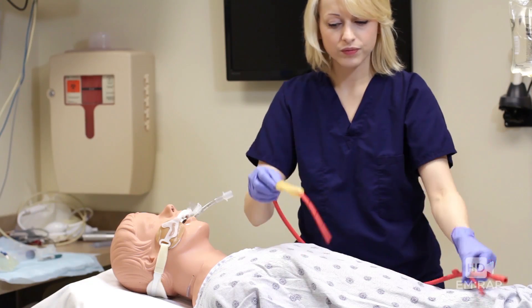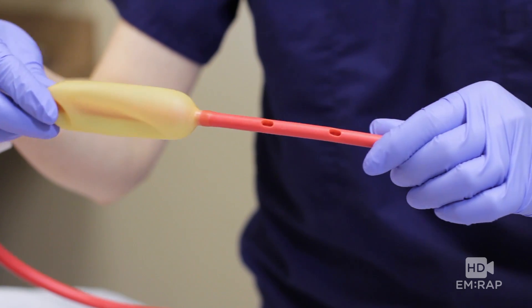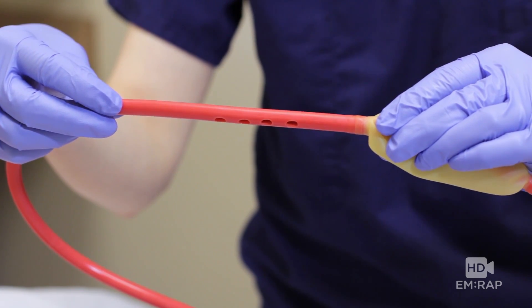Pop quiz! How do you know this is a Linton tube? Just one balloon — it goes in the stomach. And here's the suction holes for the stomach, and the suction holes for getting those goombas out of the esophagus.